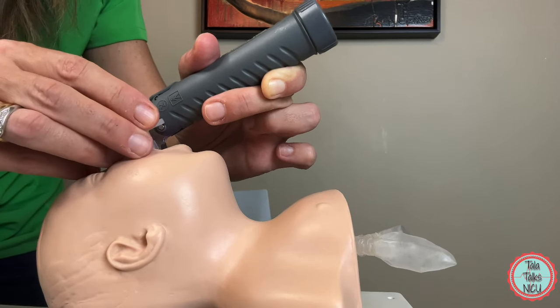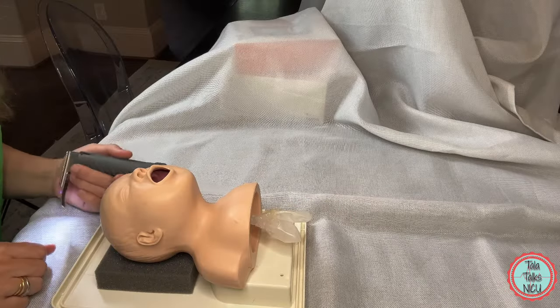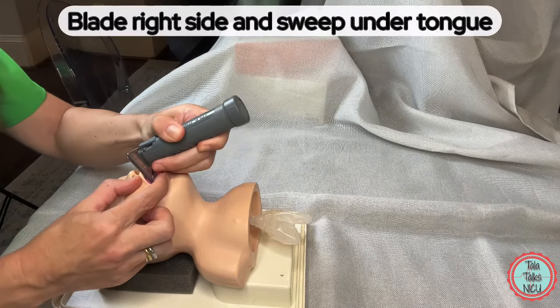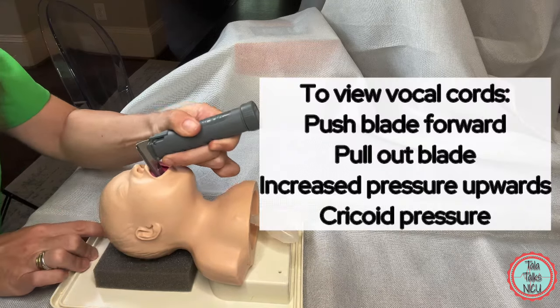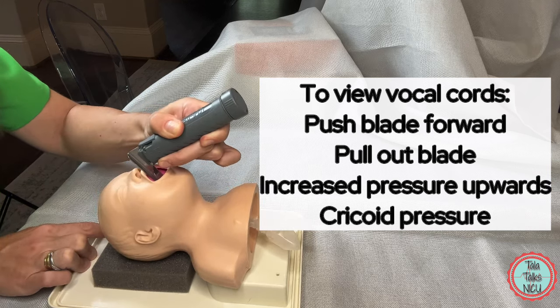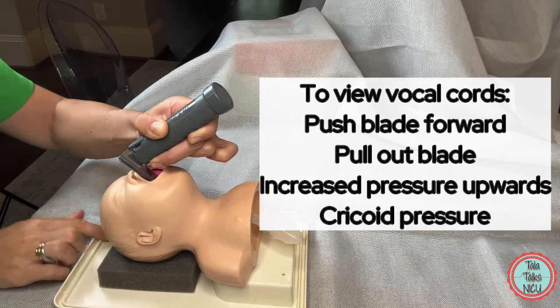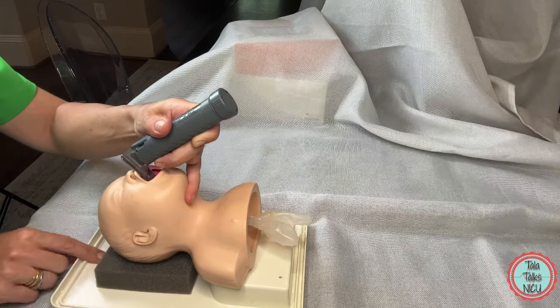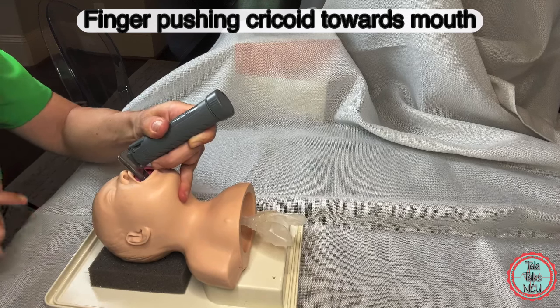I think you can actually see this endotracheal tube go down into the lungs. So once again from another angle: use the right hand to open the mouth, put the blade in on the right side and sweep up under the tongue, then try to get a good view of the vocal cords. You can push forward and back with the blade hoping the cords drop into view, or push up towards the ceiling — the head of the blade is trying to go to where the ceiling and the wall meet, which is about 60 degrees. If you still can't see anything, use cricoid pressure with your pinky finger, pushing down on the cricoid, hoping it will help the cords drop into view.